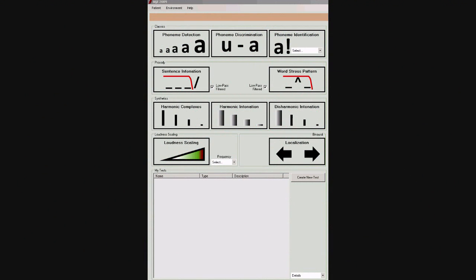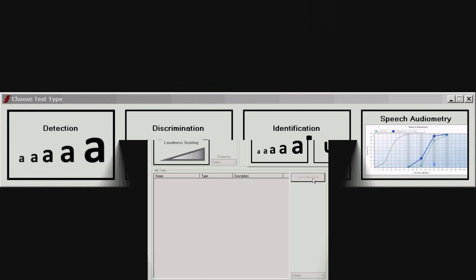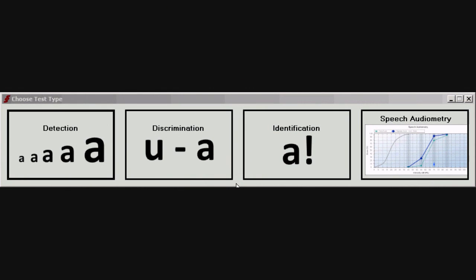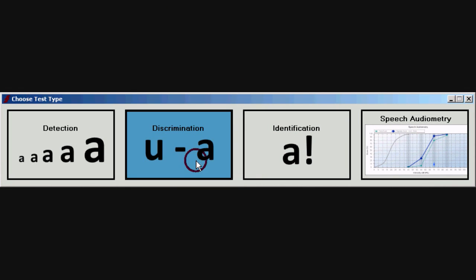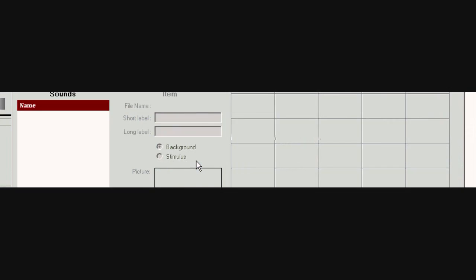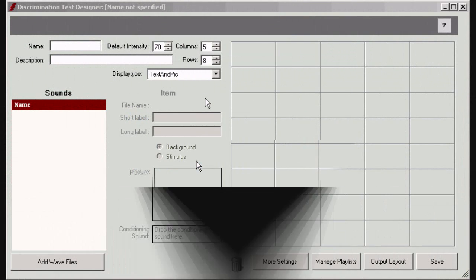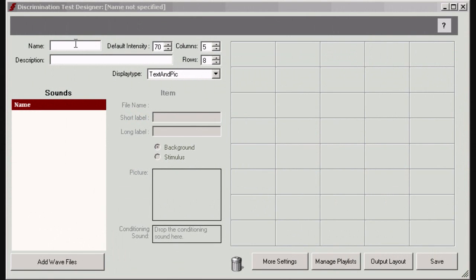You need test designer rights to create your own discrimination test. Only the ACE user with administrator rights can change your authorization level. Click on the create new test icon, then click on the discrimination icon. This will allow you to create a new test based on the engine of the ACE phoneme discrimination test.